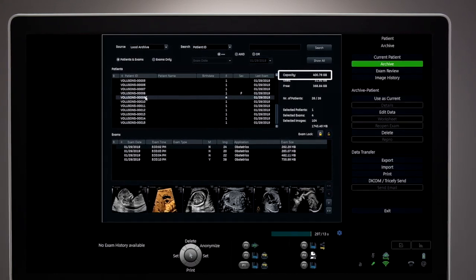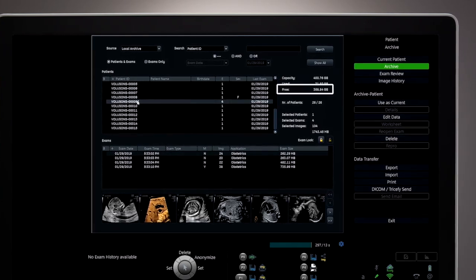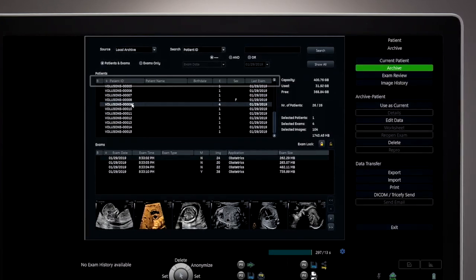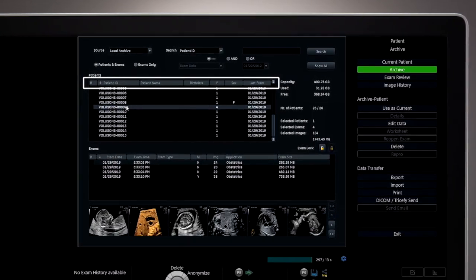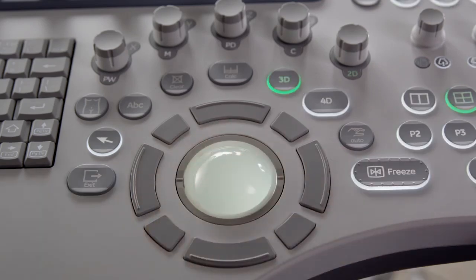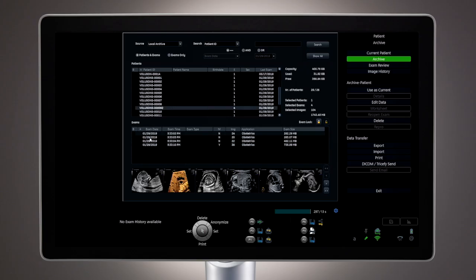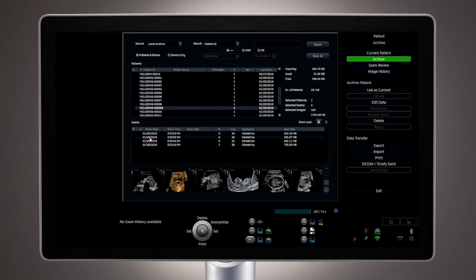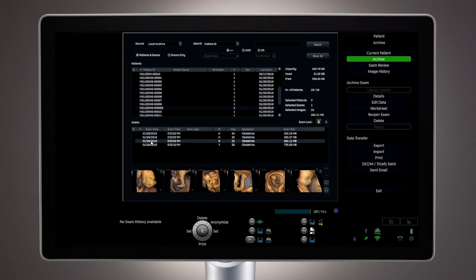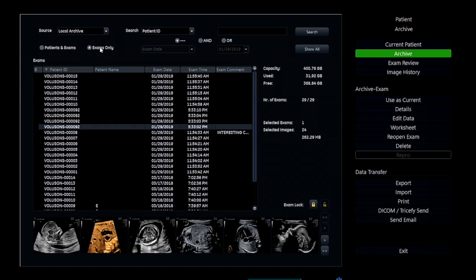The display next to the archive shows the capacity as well as remaining space available. The patient list can be sorted by any one of the fields along the top with the trackball and set keys. Once a patient is selected from the list, all of the exams for that patient will be listed in the window below. There is also a way to list exams only, which allows for additional fields such as exam comments.